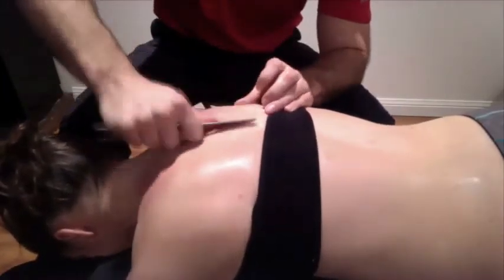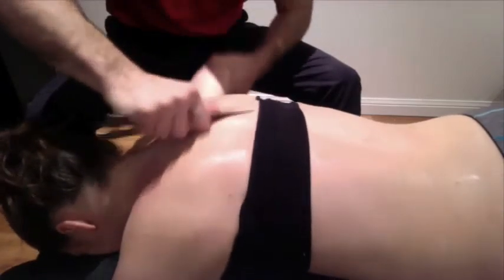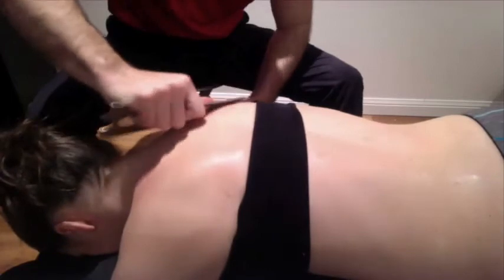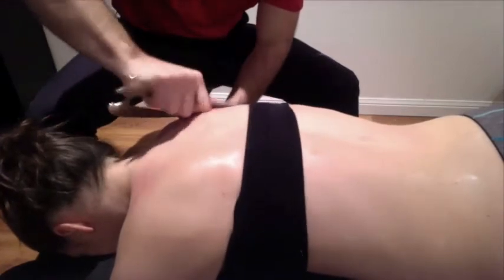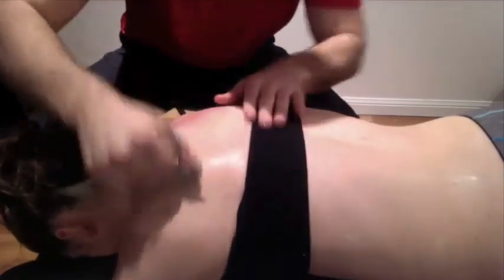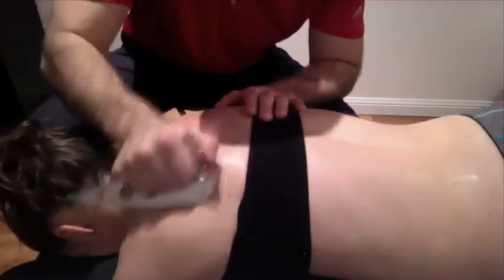Now we're going to continue to treat through those rhomboids. I'm going to grab this free arm here, so she's going to keep it nice and loose for me, and we're going to find those lines of tension to get through the rhomboid. There's some nice tension there. We would do the same thing on the other side as well — a little bit hard for me to reach across her body right now, but we can still attack that without doing any of that.